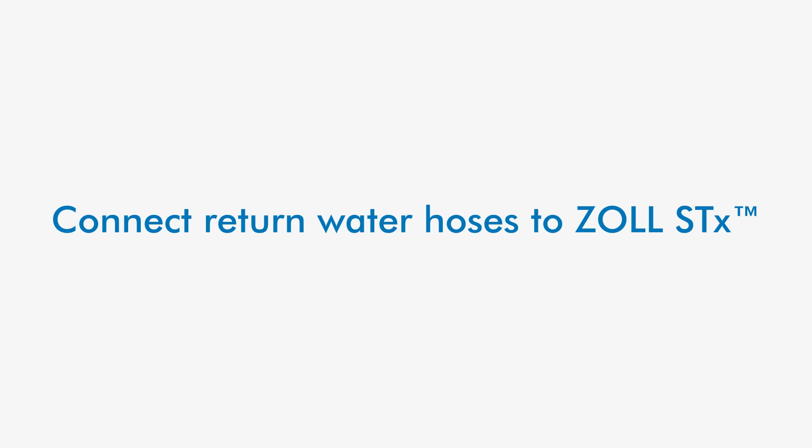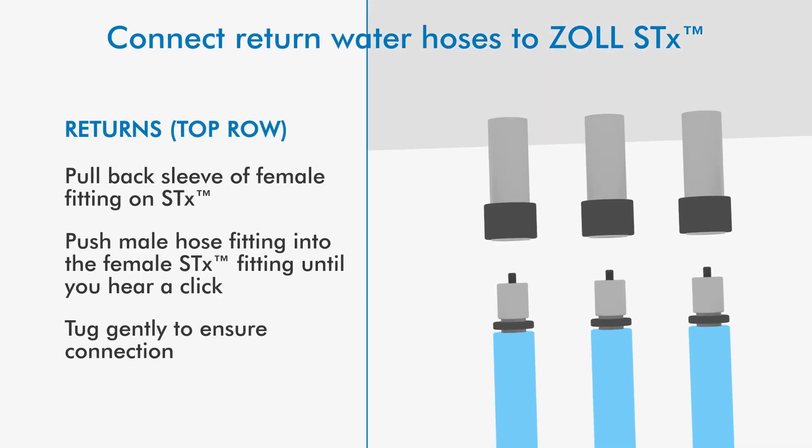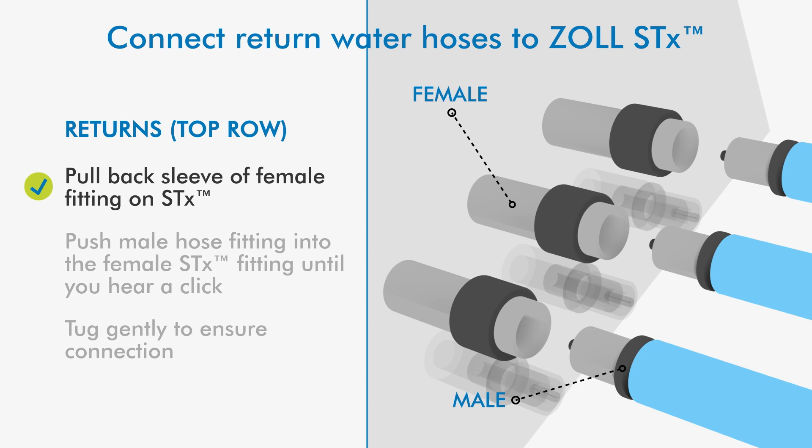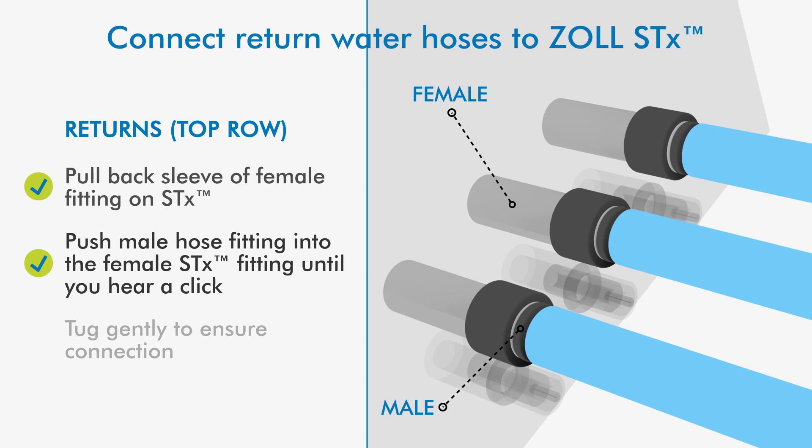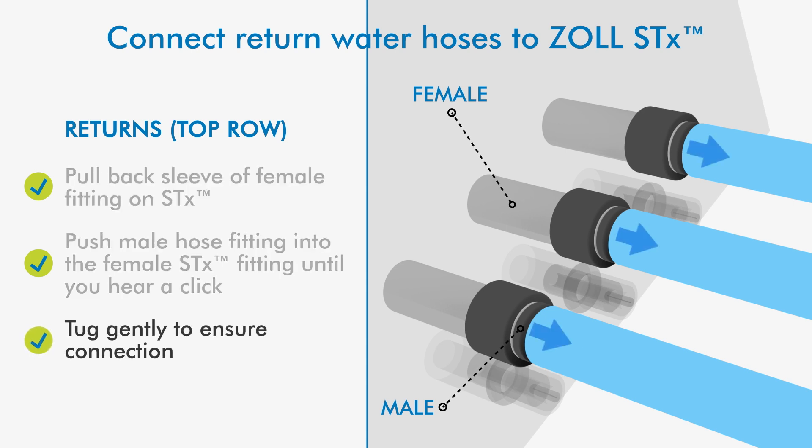Connect return water hoses to the console. Pull back the sleeve of the female fitting on the STX and push the male hose fitting into the female STX console fitting until you hear a click. Tug gently to ensure connection.